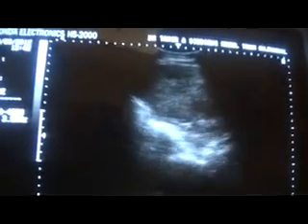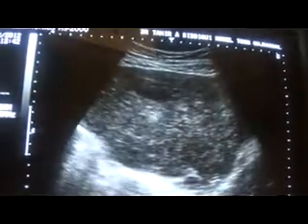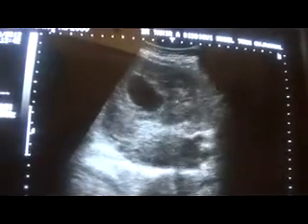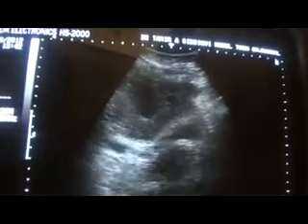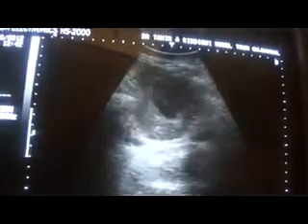This patient was referred for sudden distension of the abdomen, in which, as I place the probe in the suprapubic region and try to get the urinary bladder, this is the urinary bladder which is almost empty. This is the urinary bladder, it is empty. Okay, and we go to the longitudinal section to get the uterus as much as I can.